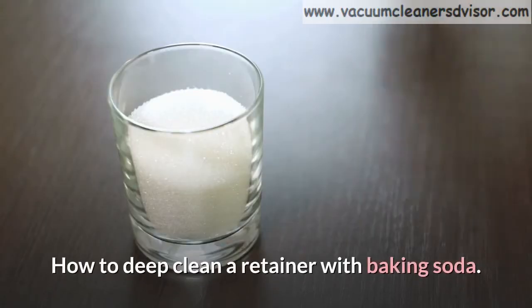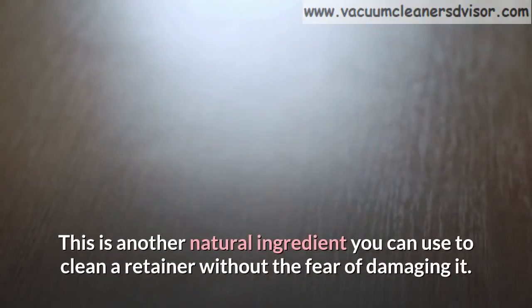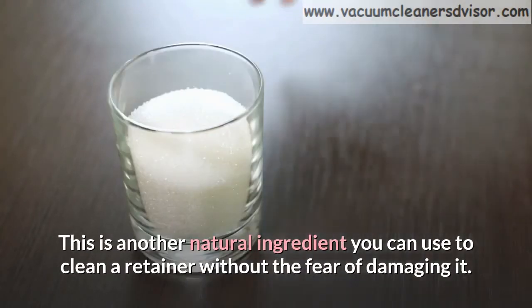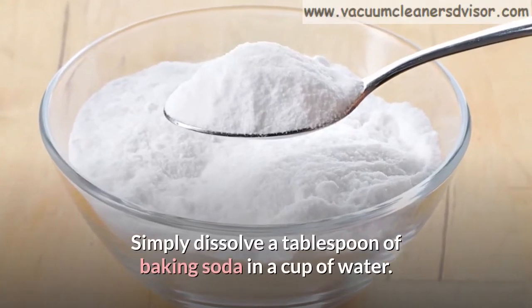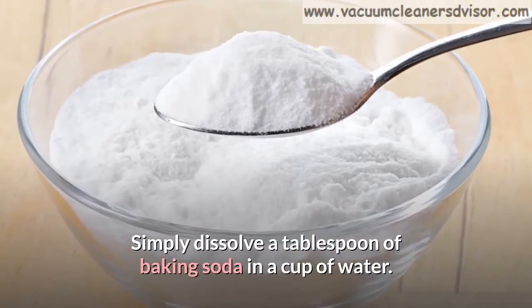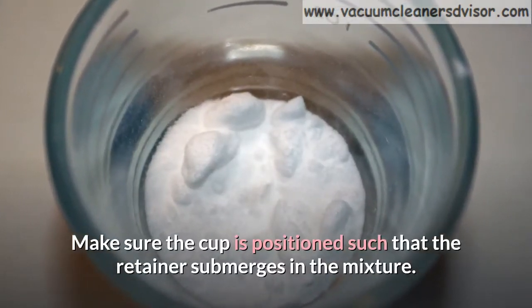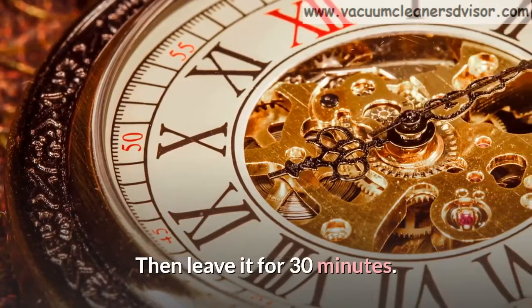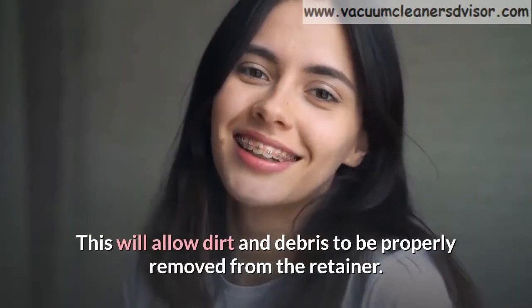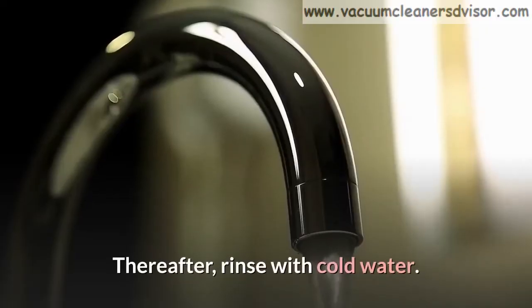How to deep clean a retainer with baking soda. This is another natural ingredient you can use to clean a retainer without fear of damaging it. Simply dissolve a tablespoon of baking soda in a cup of water. Make sure the cup is positioned such that the retainer submerges in the mixture. Then leave it for 30 minutes. This will allow dirt and debris to be properly removed from the retainer. Thereafter, rinse with cold water.